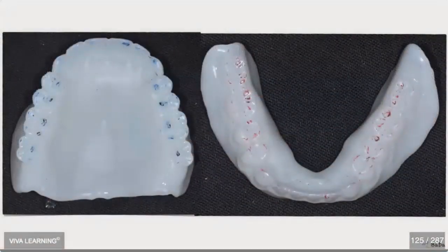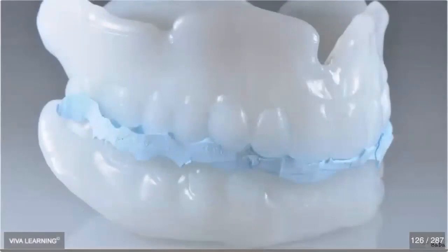Now, in that case, sometimes you have to adjust the occlusion. And if you notice here that I adjusted the occlusion on the upper right side, what that means is now I have changed what Lee has provided me. And all what I have to do to correct that is grab a centric relation record. And what he has to do now is to scan the cameo surface of the dentures where the teeth are, and where I adjusted the occlusion, and then remount that virtually and take it from there.